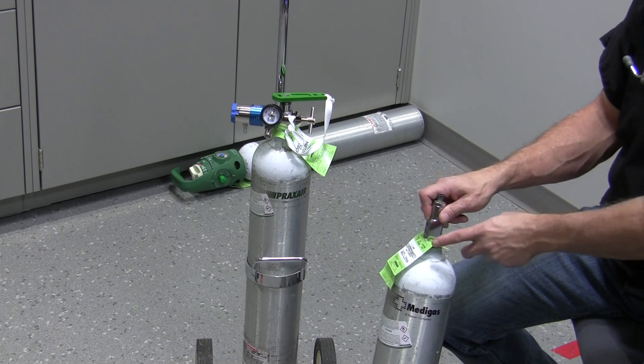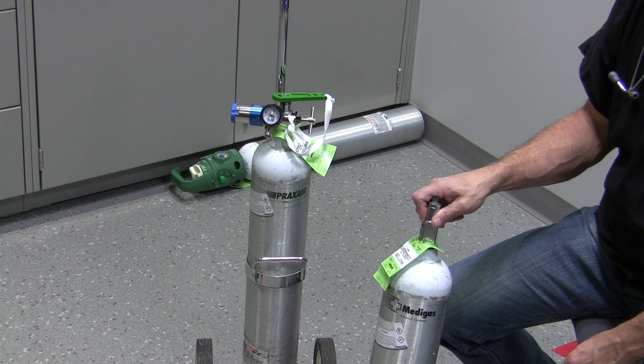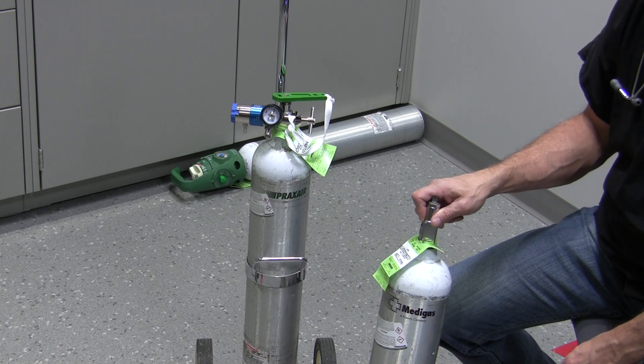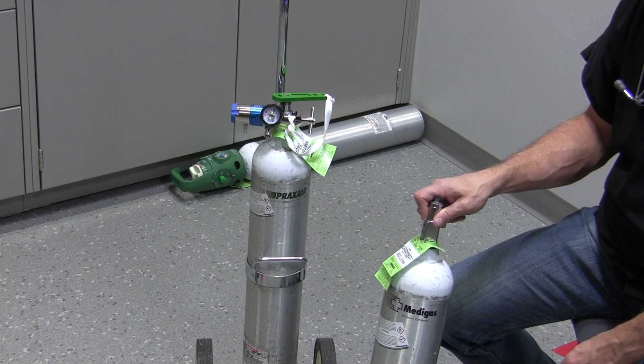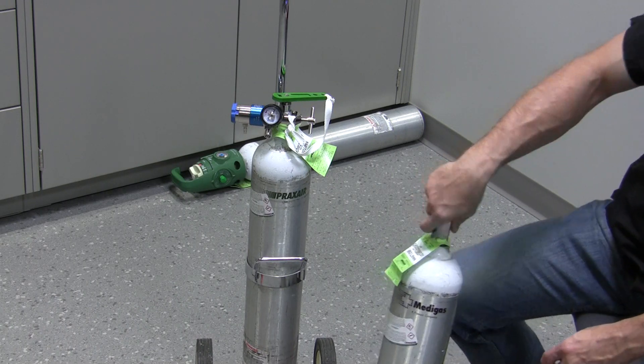They're all, with this type of stem system, safely handled with the correct safety system. And the safety system is the Pin Indexing Safety System, or PISS — commonly called the PISS Safety System.